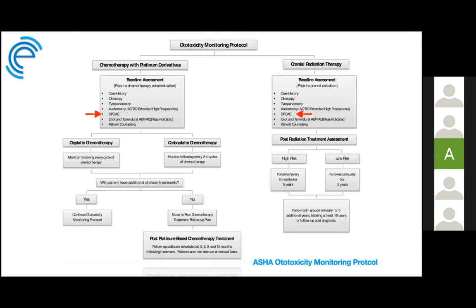So this is ASHA's ototoxicity monitoring protocol. For chemotherapy with platinum derivatives, the baseline assessment includes the DPOAE, and in cranial radiation therapy, also again, in the baseline assessment, they do include OAE.